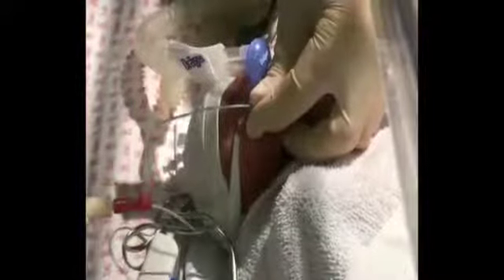Thereafter, the catheter is introduced into the trachea with the McGill forceps. The laryngoscope is removed and the surfactant is instilled while the infant is breathing spontaneously.